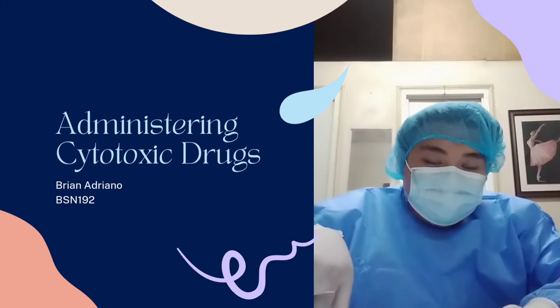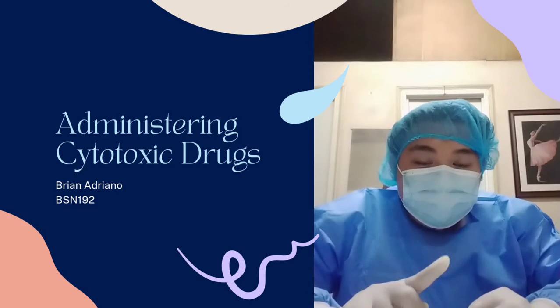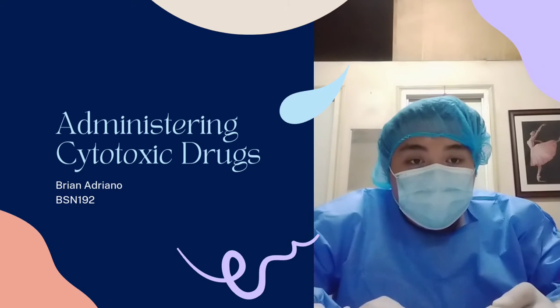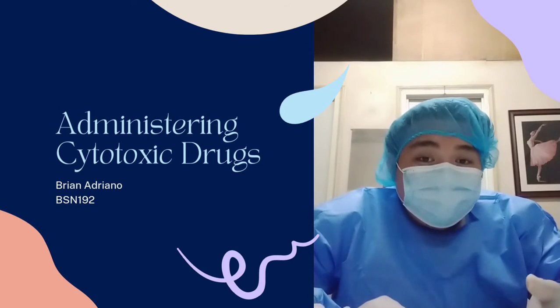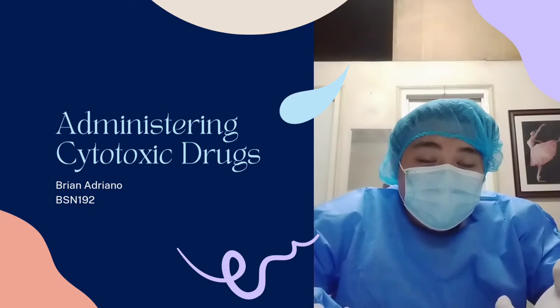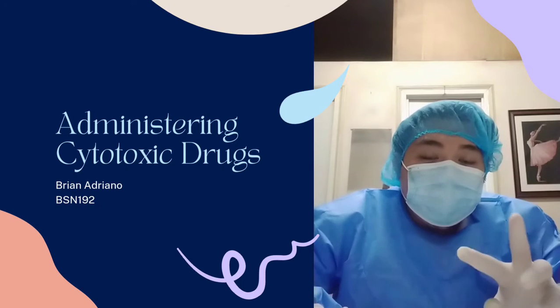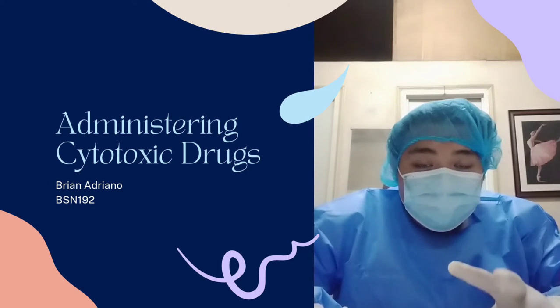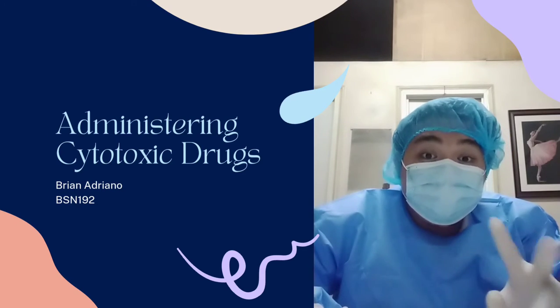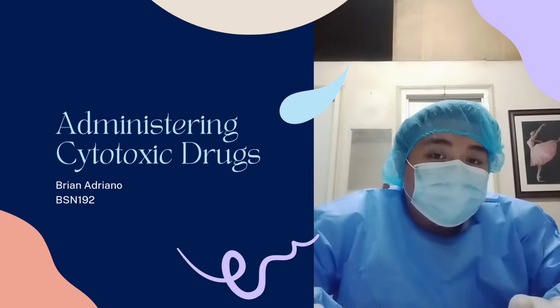Cytotoxic drugs have two different kinds of administration to the patient. One is the oral route, or the oral cytotoxic drugs, and the second is through IV push or slow intravenous infusion. So for this video, I will be performing the slow IV infusion.